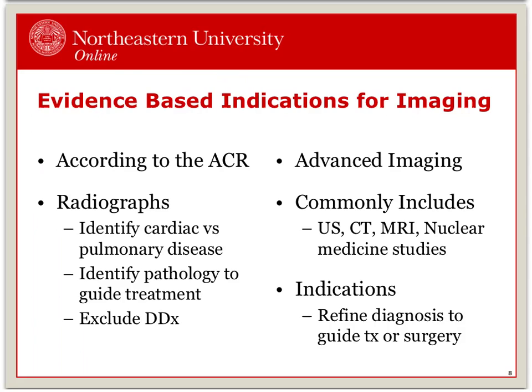The American College of Radiology publishes appropriateness criteria. So the evidence-based indications for imaging for radiographs are to identify cardiac versus pulmonary disease, to identify pathologies that will guide treatment, and to exclude differential diagnosis.